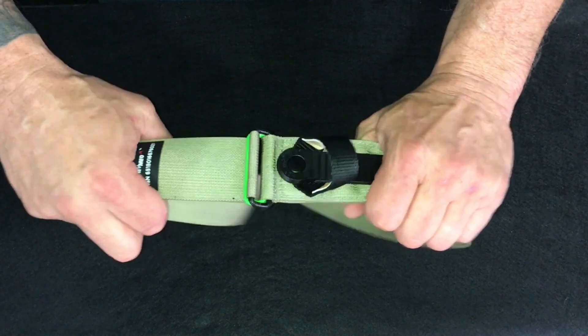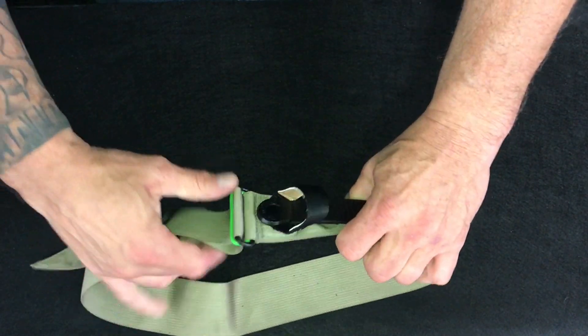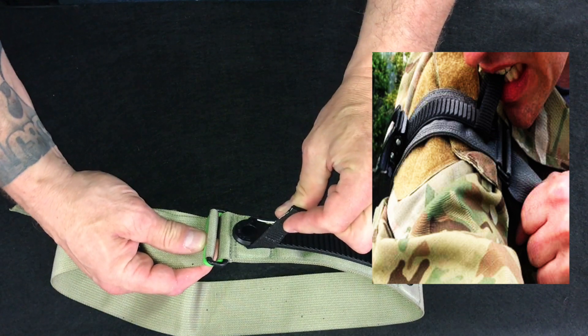The green ring on the bottom is slightly smaller to provide a better bite and ensure it never slips. The thumb loop provides a counter pull when tightening the webbing. This loop can also be used as a bite loop when self-applying to your arm.